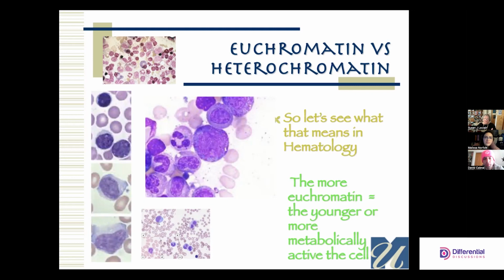But it's moving along. And then let's just look at this blast for a moment. There is a nuclear membrane there. It's just really hard to see. And it's soft and almost cotton ballish when you think about it. It's got these little almost extrusions of nucleus that are coming out because that nuclear membrane doesn't have any strength to it.